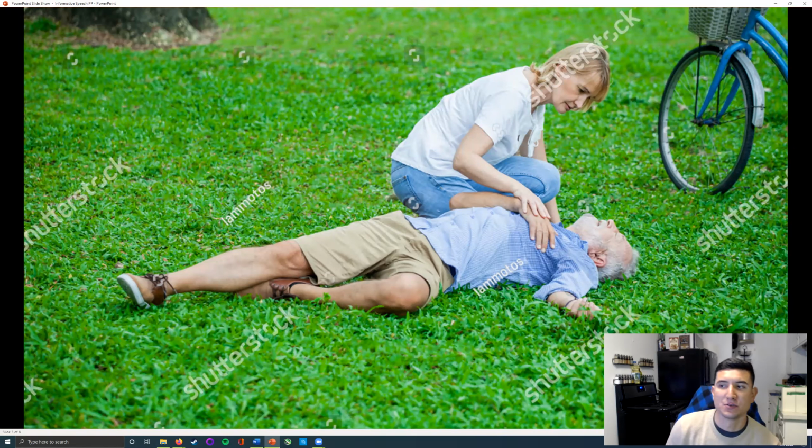The National Institute of Health estimated that from 2011 to 2015, 1,700 people were saved each year by bystanders that used an AED in a public space. So they're very, very good at saving lives when it comes to people that have suffered sudden cardiac arrest. People that get an AED used on them within the first couple minutes have an almost 3 times higher chance of surviving, according to heart.org.